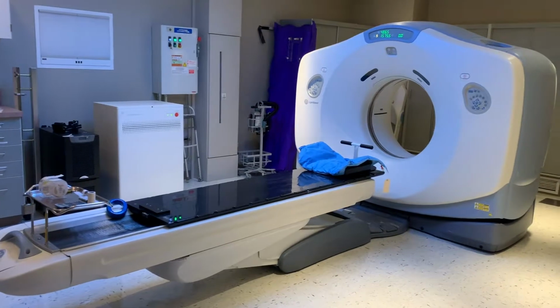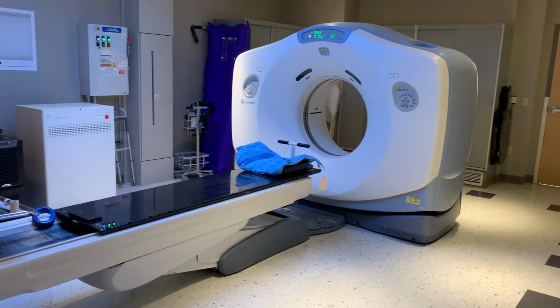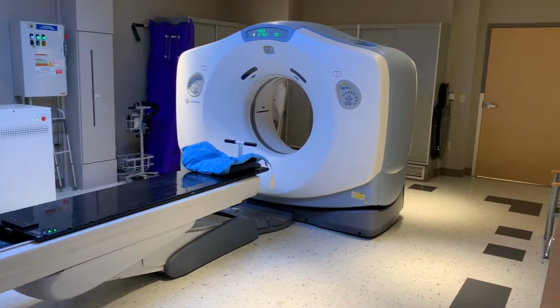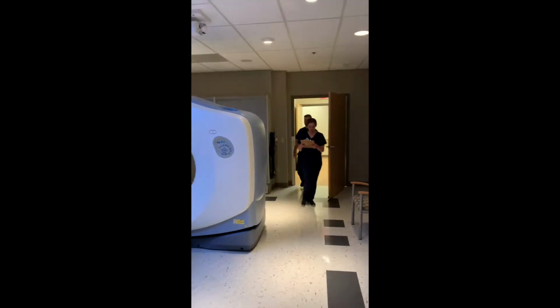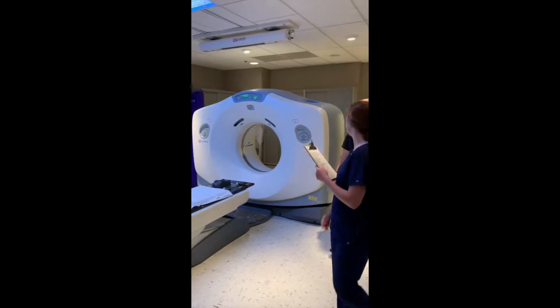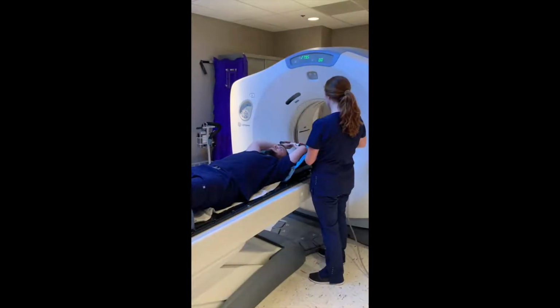Simulation is part of the process to receiving your radiation therapy treatment. This is the first step in the process after you have met with the doctor and have decided you want to proceed with radiation therapy. Here in simulation, we will take a CT scan of you in your treatment position so that our dosimetry team, along with your doctor, can begin the planning process of your treatment.